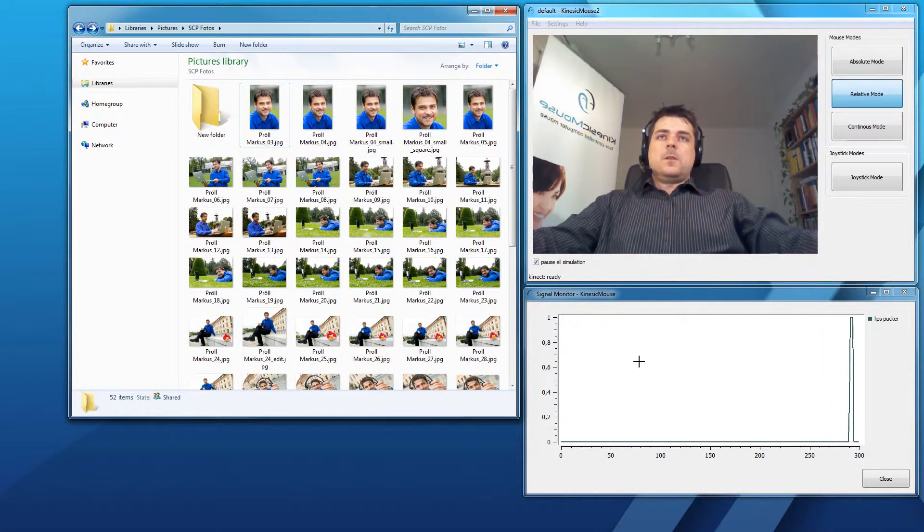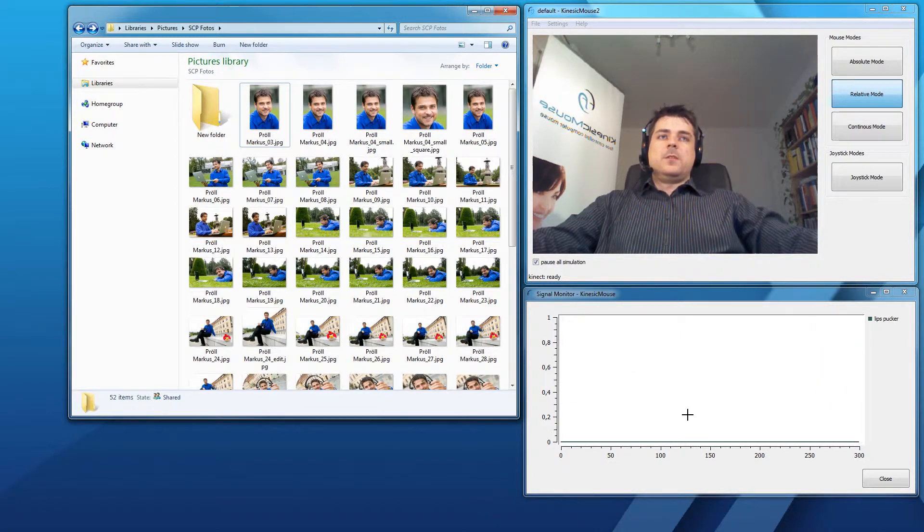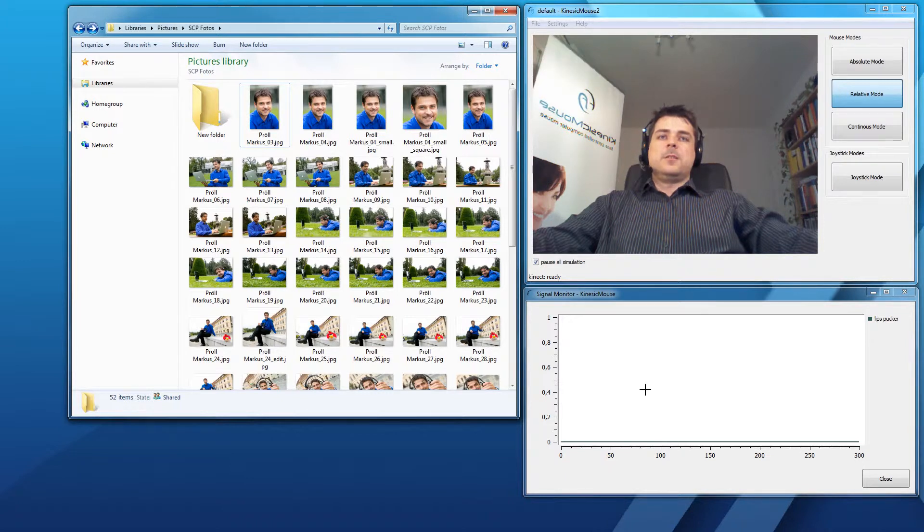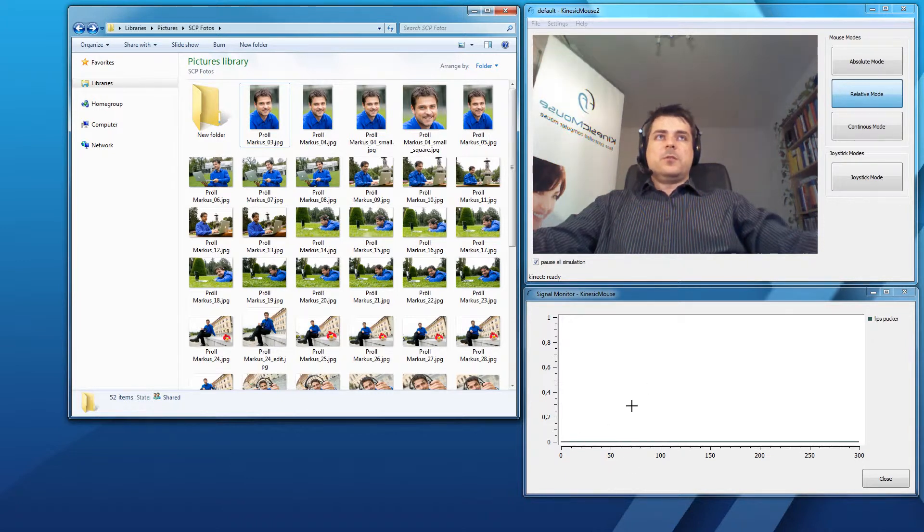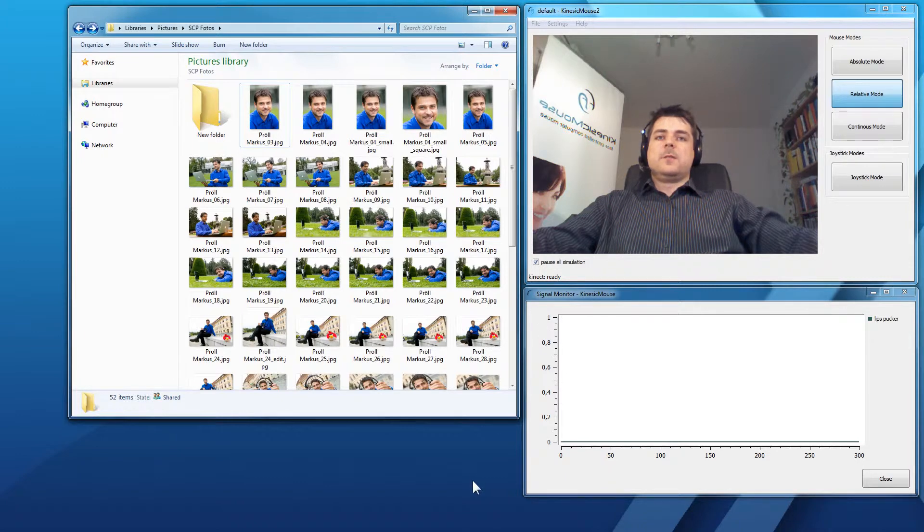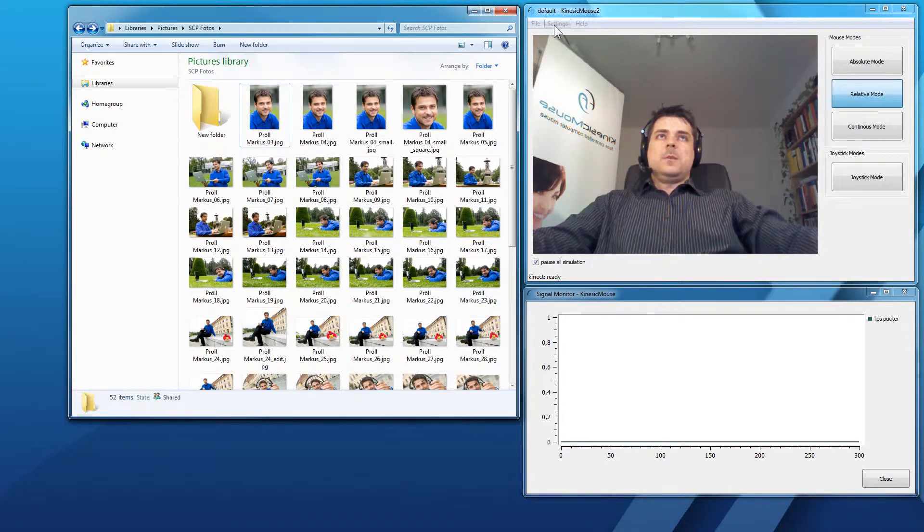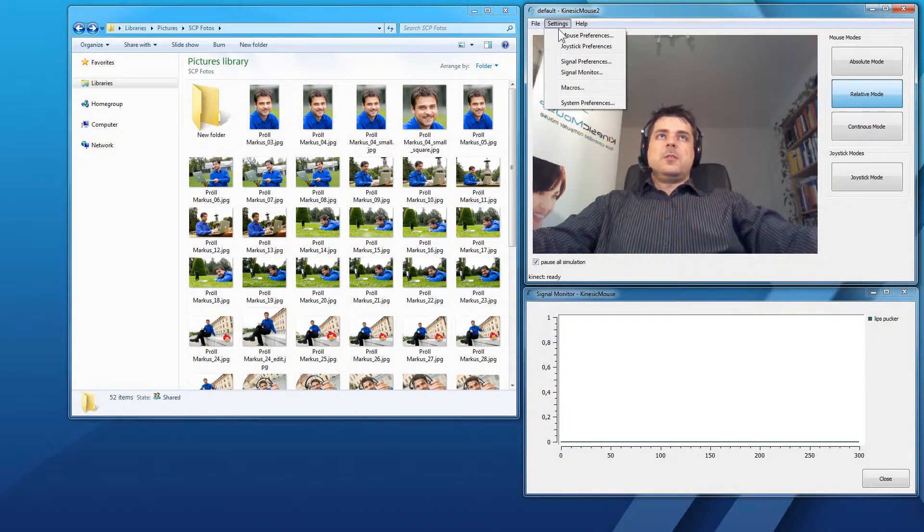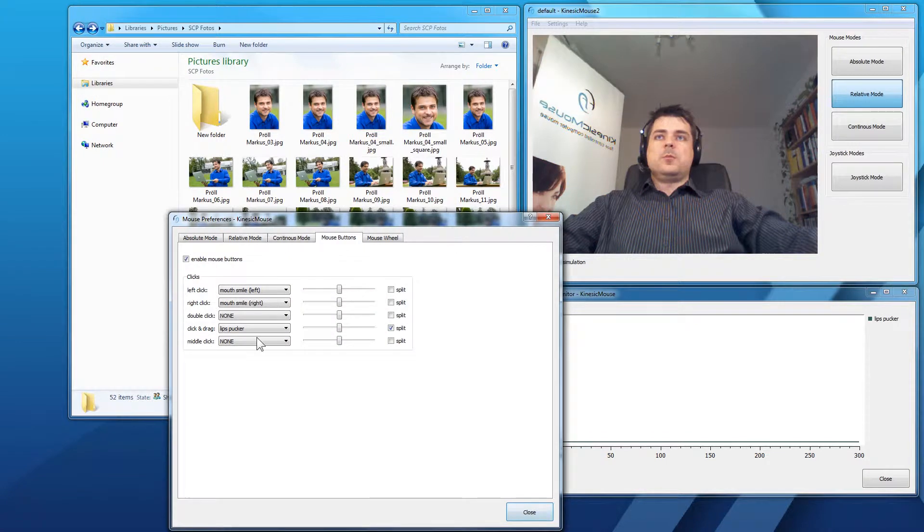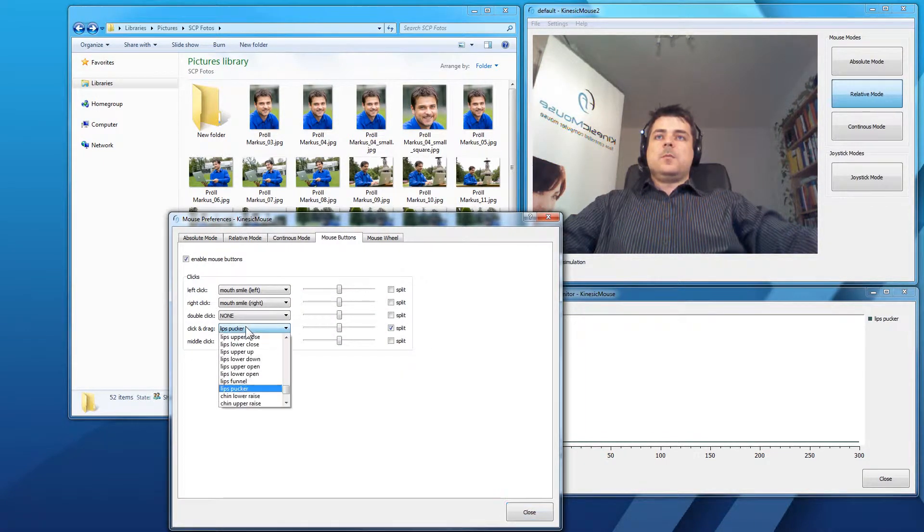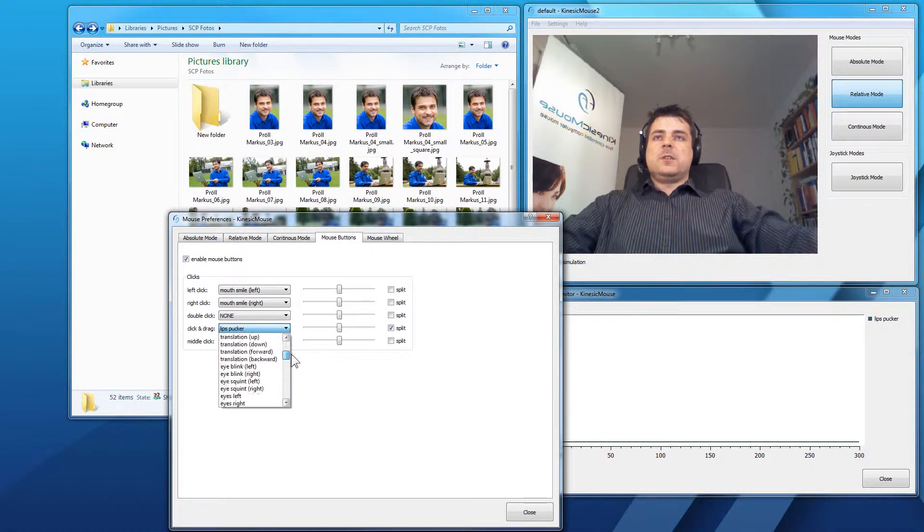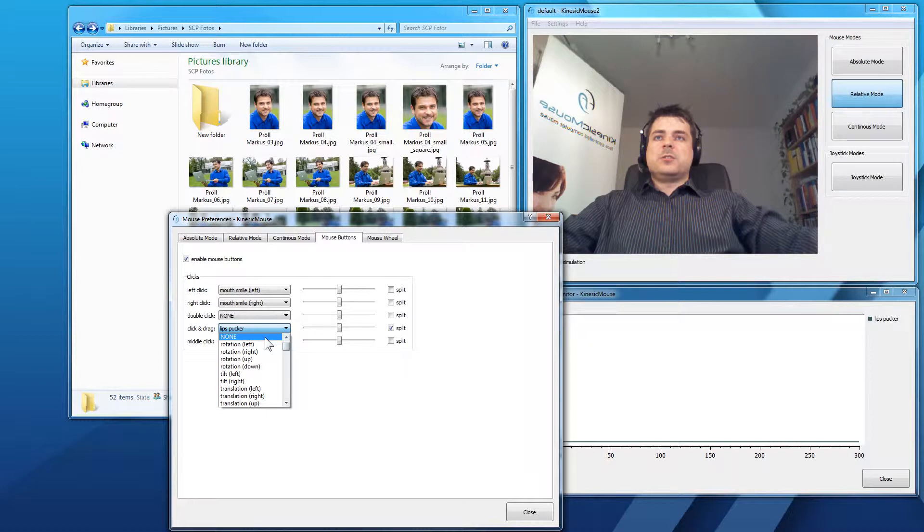Now, there is a third option. If you are really confident with your left click for example, you can also use the split function to perform a click and drag. So, let me show you how this will work. So, go to mouse preferences and we don't actually use this click and drag function.